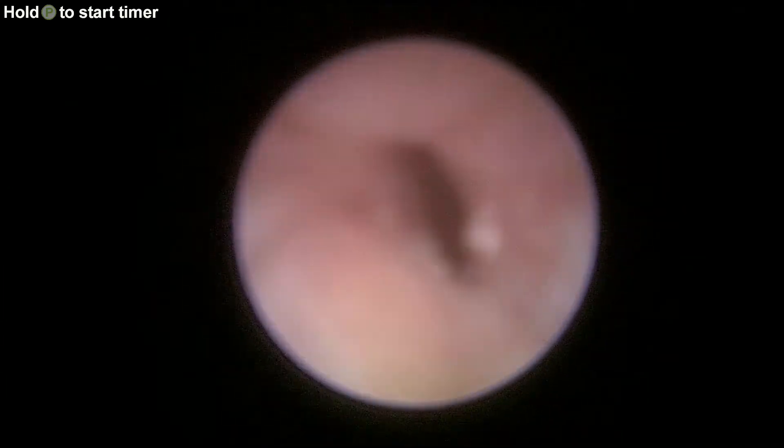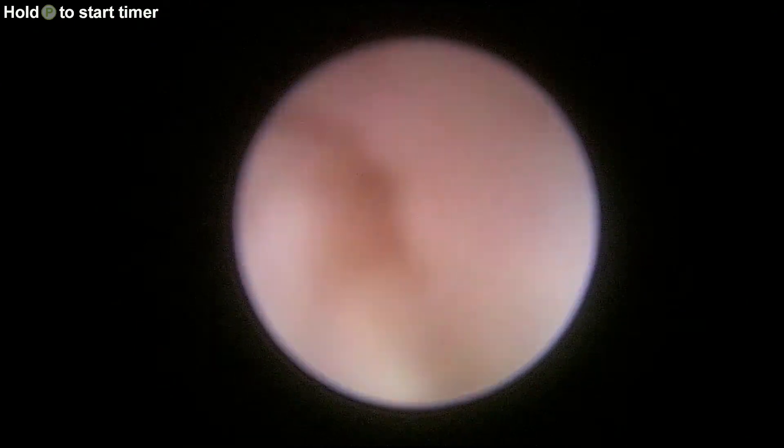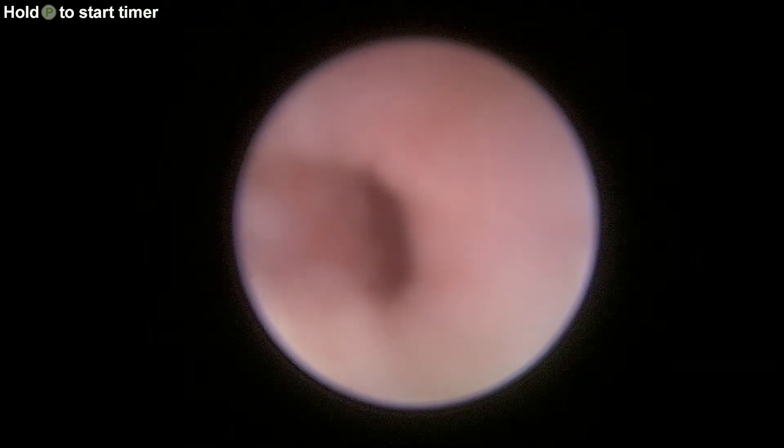Now the ureterocele has been completely de-roofed and we can see the opening or the orifice of the ureter, which is clearly visible over here.